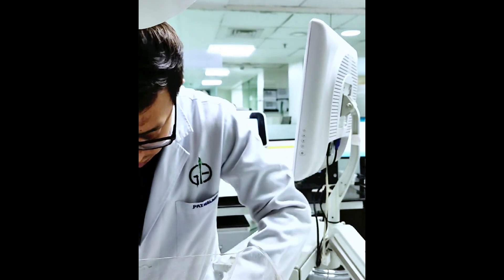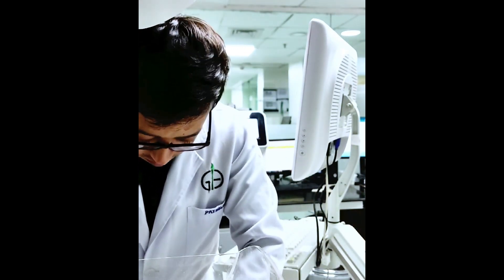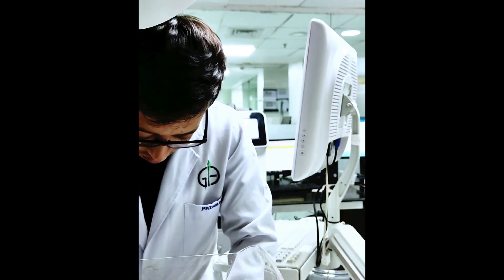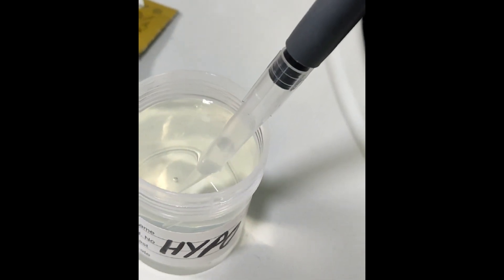Now we begin the internal draining procedure with hypochlorite solution to remove serum debris. We pipette 1000 microliters of hypochlorite solution into the sample probe holes, five times.